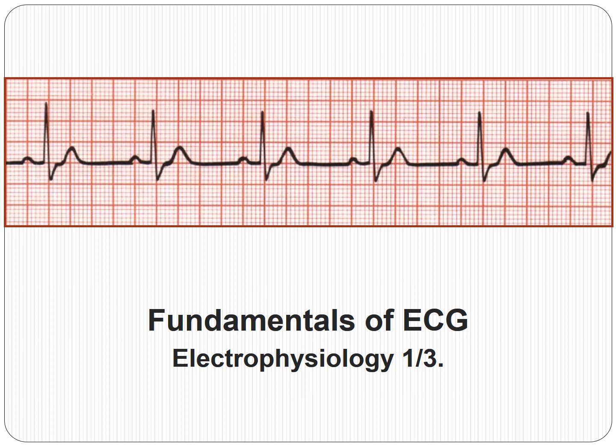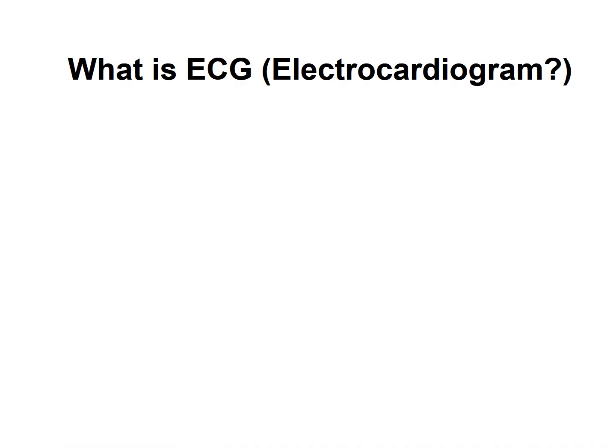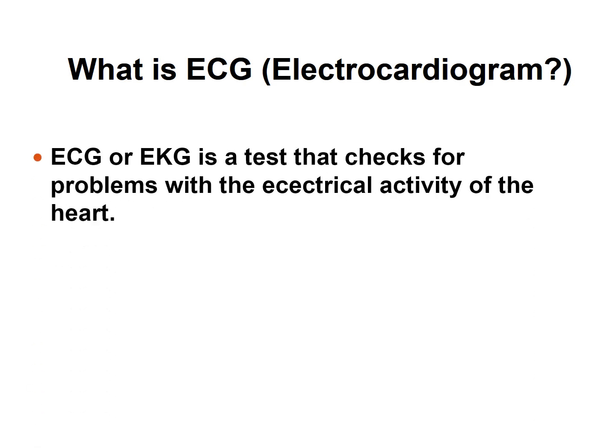Fundamentals of ECG, the first part of three. What is ECG, or electrocardiogram? ECG or EKG is a test that checks for problems with the electrical activity of the heart.